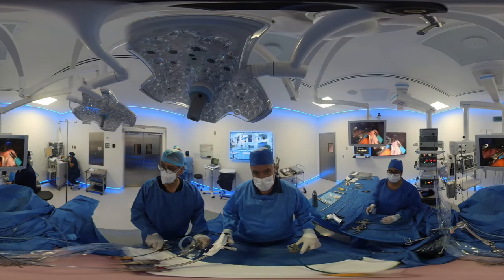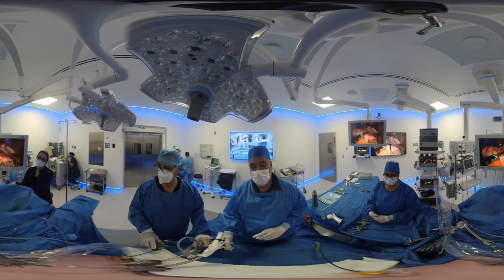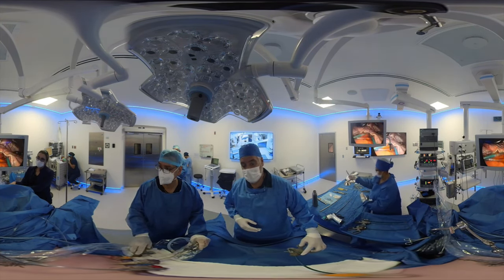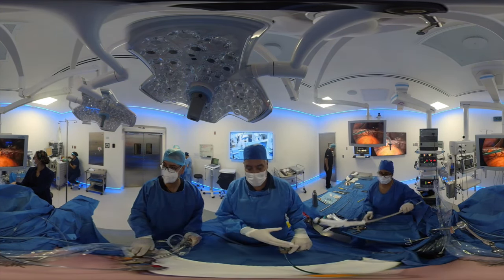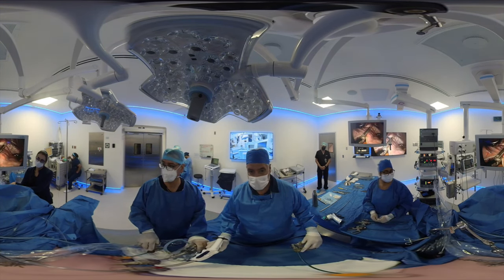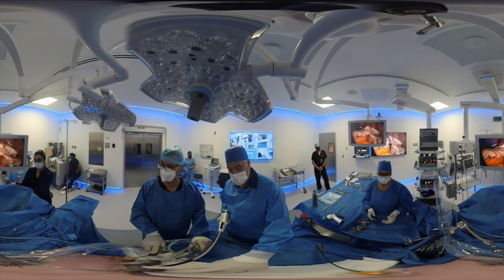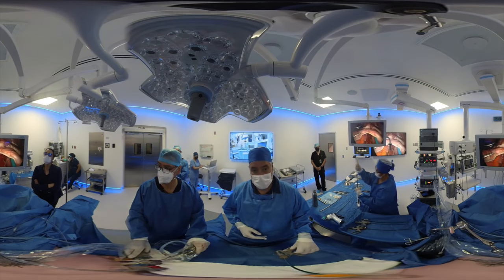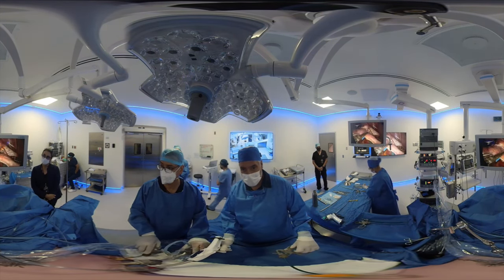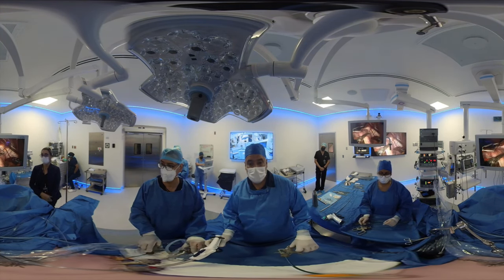We're doing a 360 video. Remember that in a 360 you can scroll around or move your device depending on what point of view you'd like to see. I'm standing between the patient's legs facing towards her head. We're standing in front of a monitor where I'm seeing the view of the interior of the abdominal cavity — this is where we're performing the actual surgery. If you scroll down you'll see the patient's abdomen, because she's lying immediately below the 360 camera.